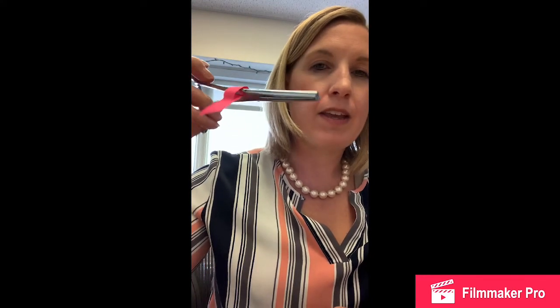Next is one of my favorite instruments. This is letter I. This is in fact the Kocher clamp. You can see the teeth on the end. I'll try to show you that end on. It's a little bit blurry, but you can still see. There you can see. This is a lot of force, so you want to be very careful with this instrument on anything other than tissues that are very strong, i.e. fascia. This is the most common use for this instrument, I would say.